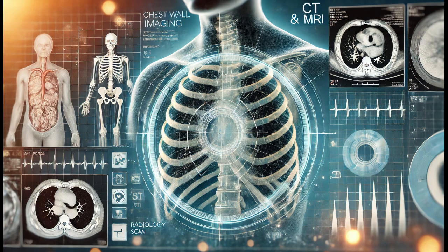Not quite. A bone island is a small, dense area of bone that shows up as a white spot on an X-ray. They're completely harmless and incredibly common. In fact, most people with bone islands don't even know they have them. So why even mention them if they're so harmless? Because they can sometimes cause confusion.